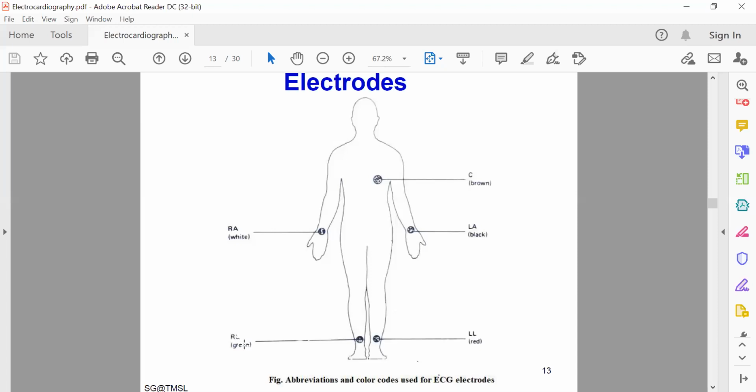So the pumping action of the heart, which generates the voltage, is actually a vector quantity whose magnitude as well as orientation changes with time. Because the ECG signal is measured from electrodes applied to the surface of our body, the waveform of the signal is very dependent on the placement of the electrode. Some segments of the trace may almost disappear for certain electrode positions, whereas others may show up clearly on the recording.